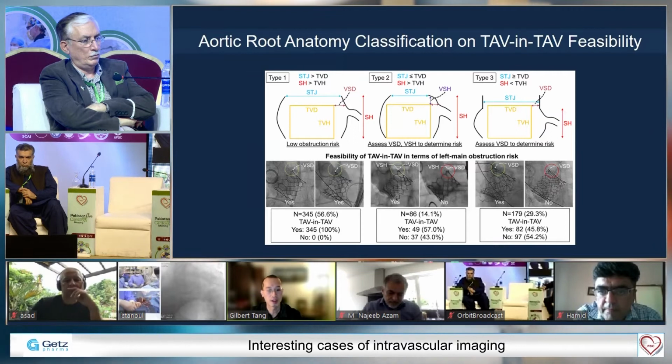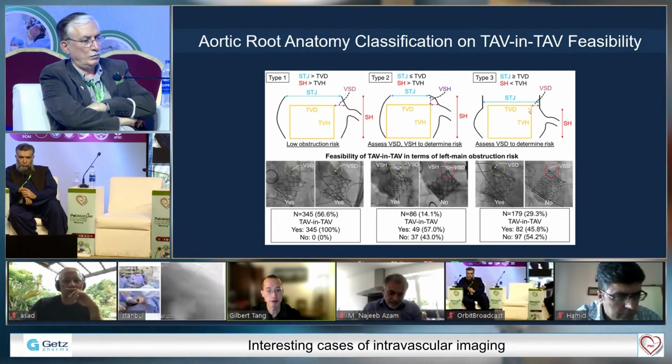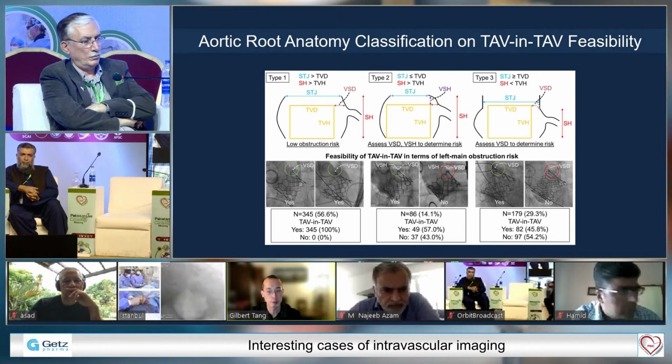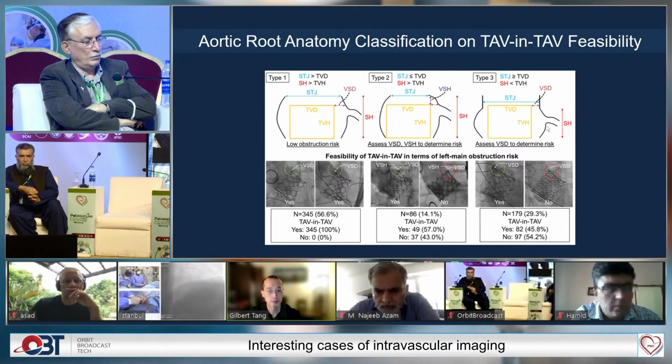So for example, with this balloon expandable valve with a shorter stent frame, it's not feasible for everyone. You can see that if you have the SAPIEN 3 valve above the sinotubular junction and you have a very narrow distance between the frame where the leaflets can be pinned to the aortic root anatomy, you can obstruct the coronary flow. And this can be up to 20%.